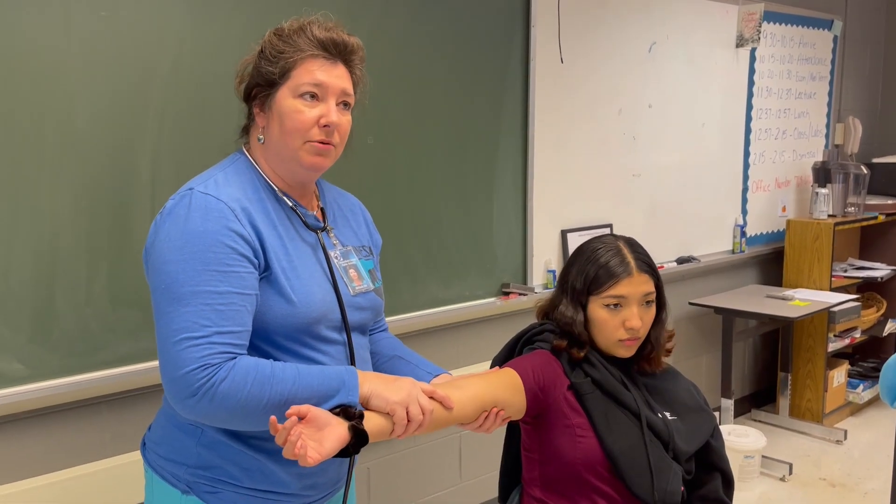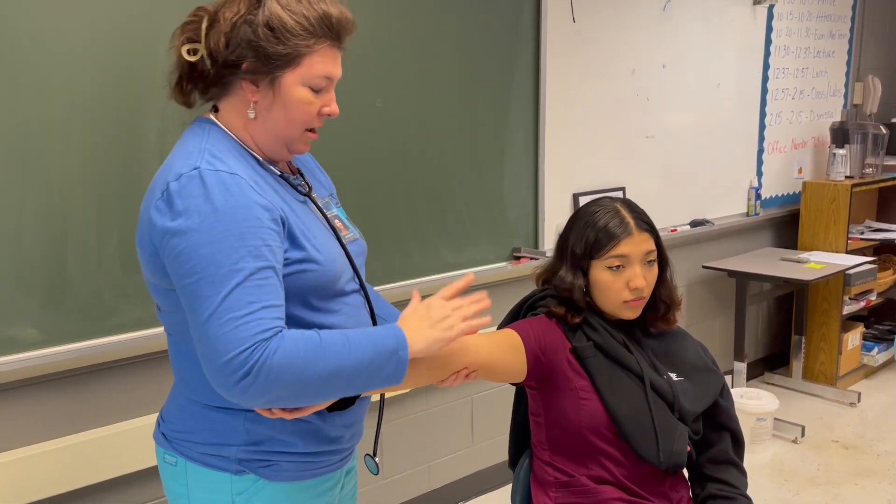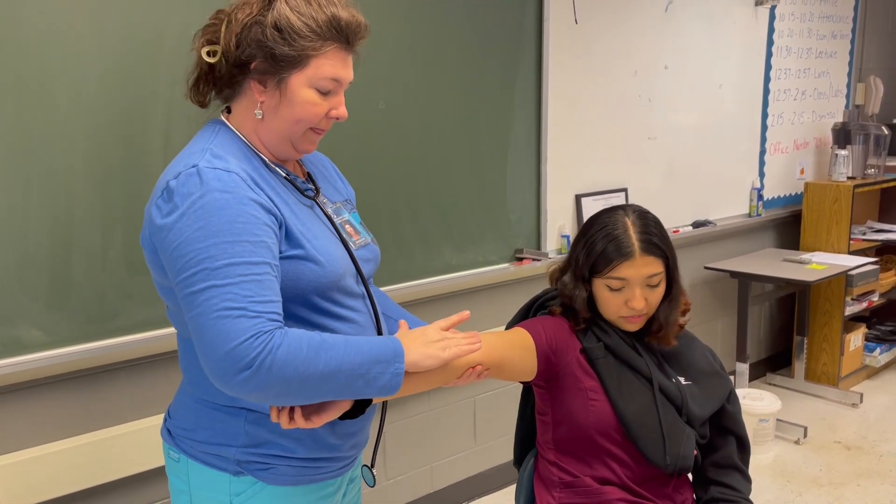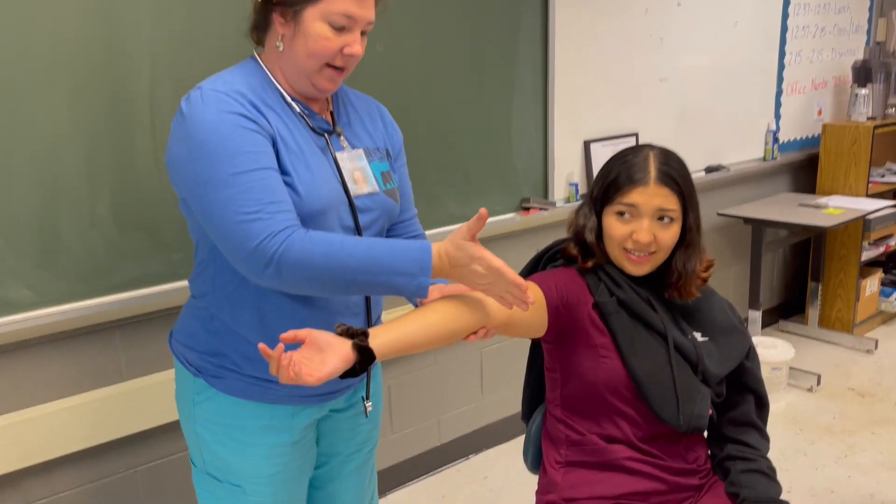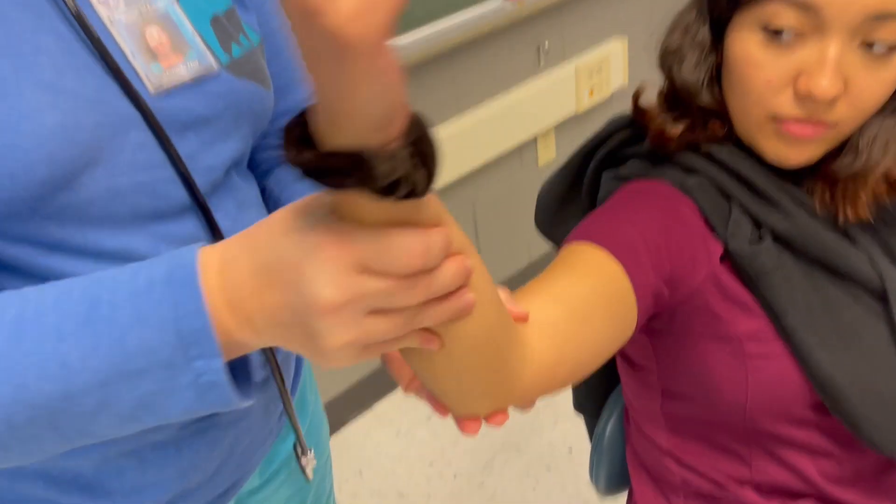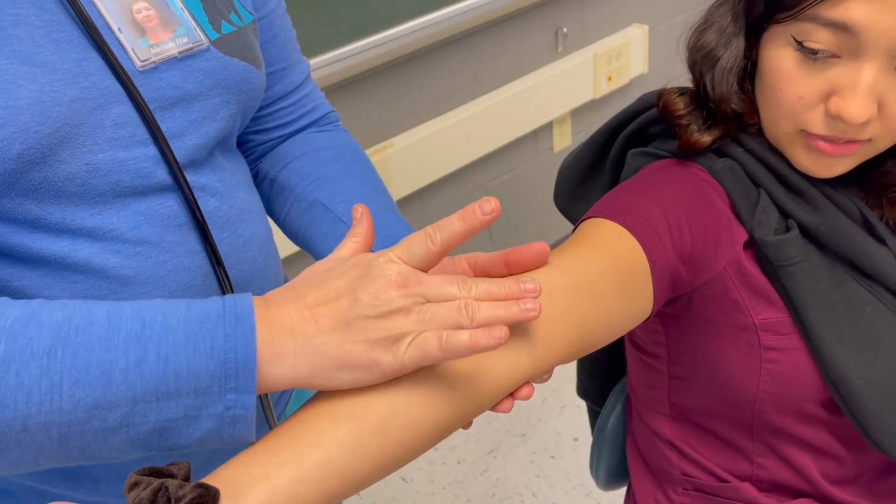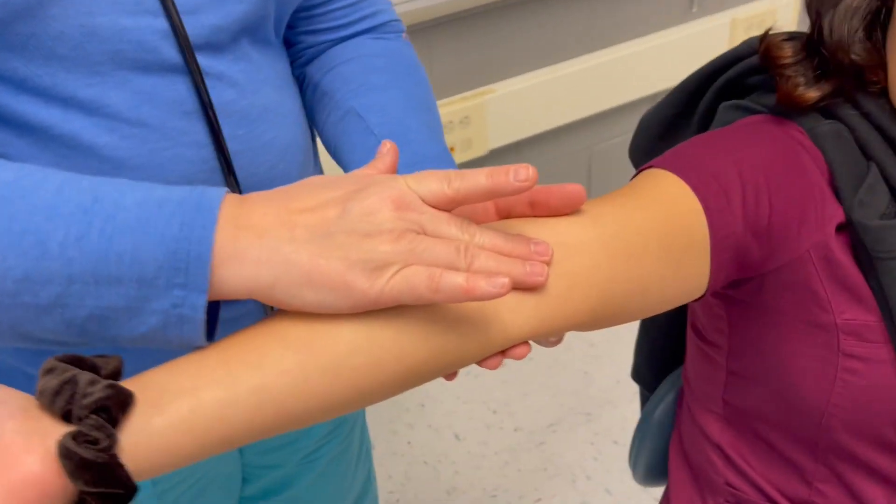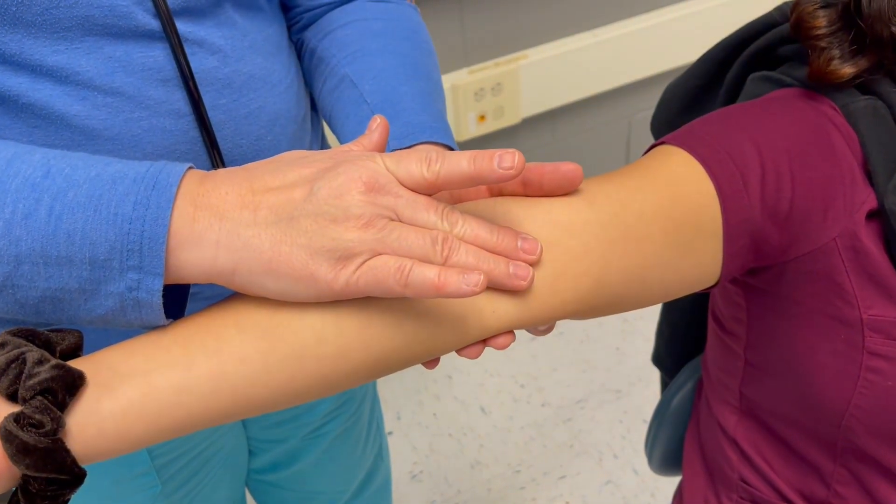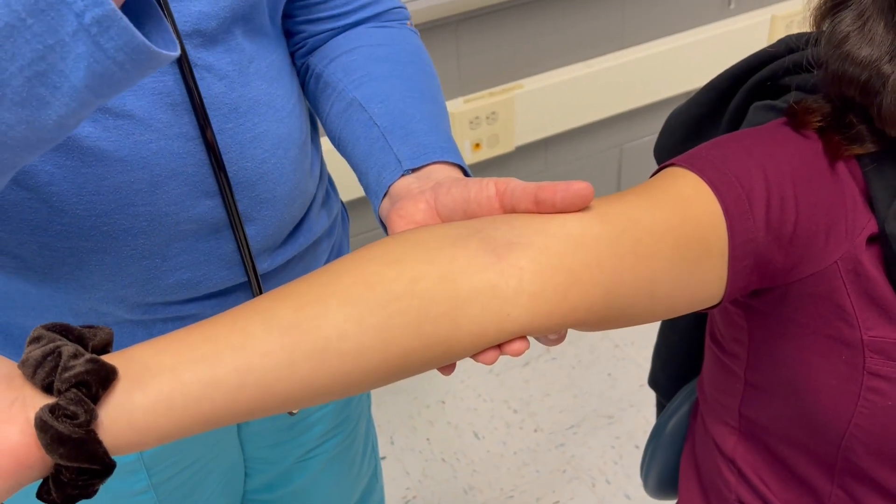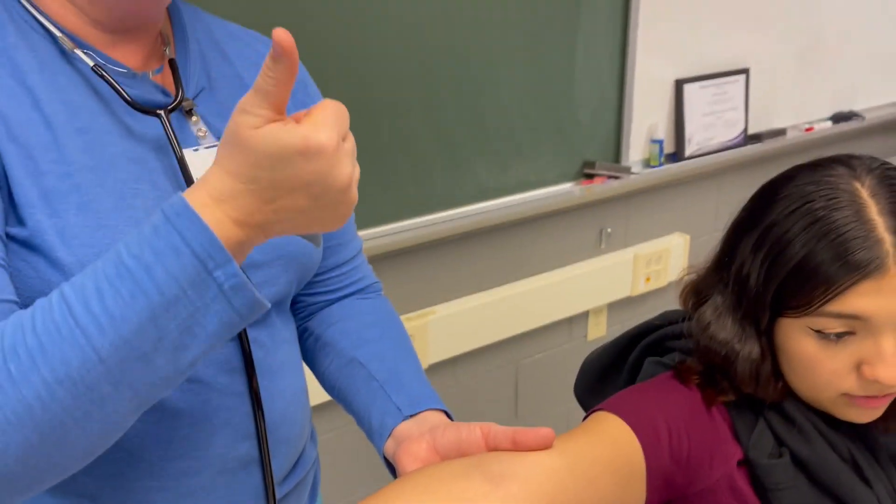So, let me show you how to properly put it on. Before I put the cuff on, I need to find her brachial artery. This is the break of her arm, and I'm going to feel with two fingers where her brachial pulse is. It's right there, really strong. Never feel with your thumb, because you have a strong pulse in your thumb.